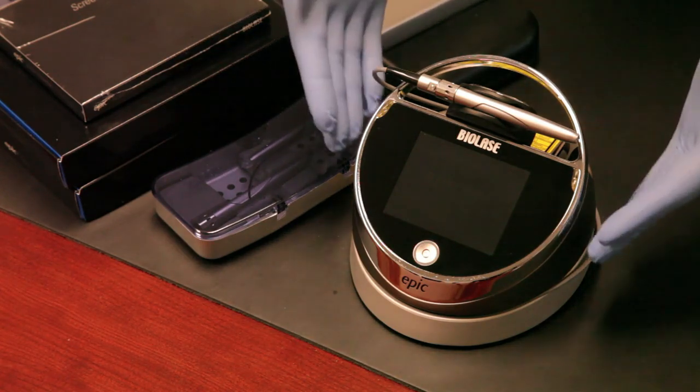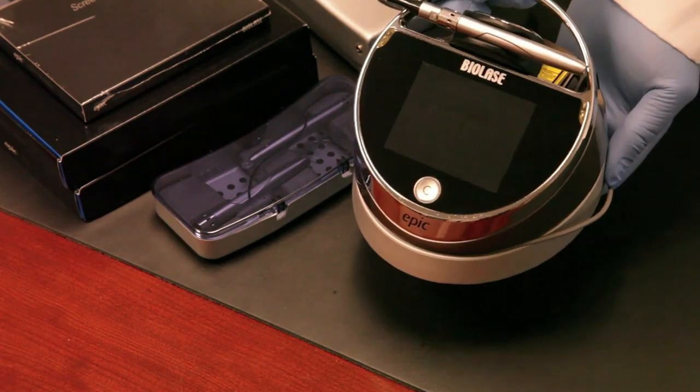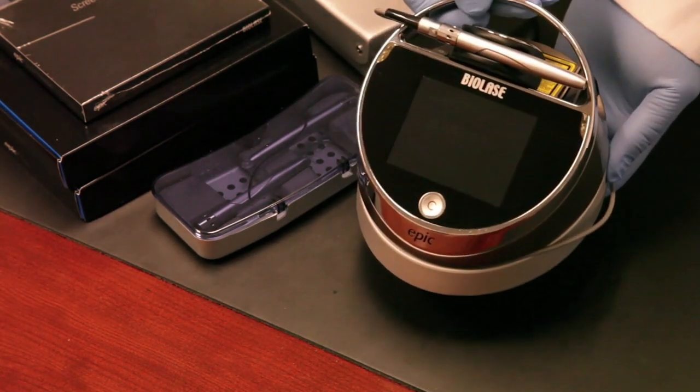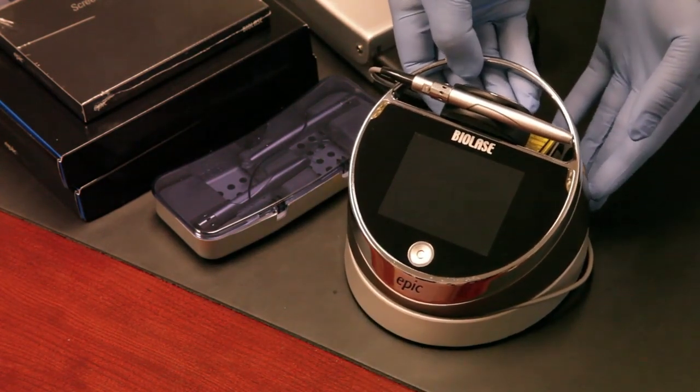The first thing you can see here is our EPIC laser. It's about four to five inches in diameter, and it's around two to three pounds — real lightweight, real easy, and a very good-looking device to have on your countertop in your operatory.